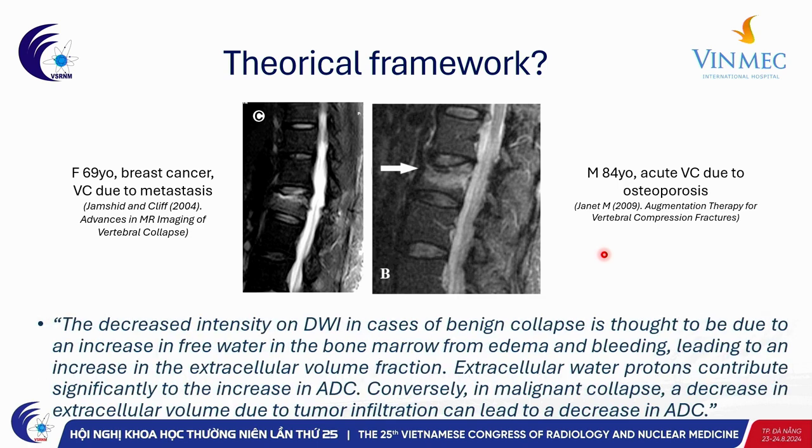So what is the theoretical framework of our study? Briefly, the signal changes, particularly in the case of vertebral compression, show high signal intensity on STIR and even on DWI images. And this signal change is due to the intracellular water and the extracellular water.